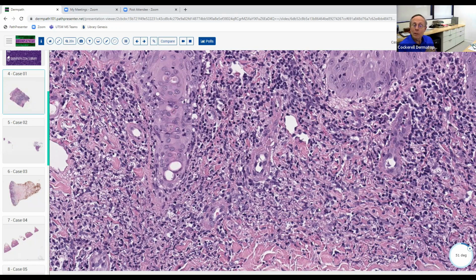And then the intrahistiocytic disorders. So this is a good type of slide that you'll probably face on the board somewhere, somehow. They will probably ask you something about this, so I would know this information.